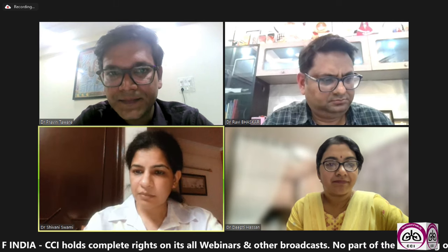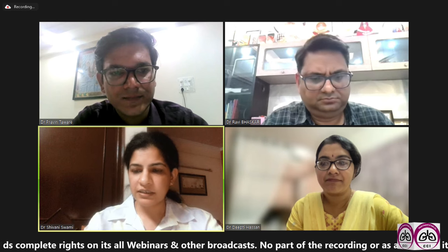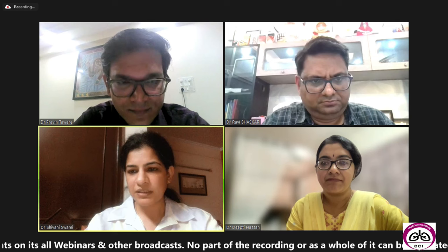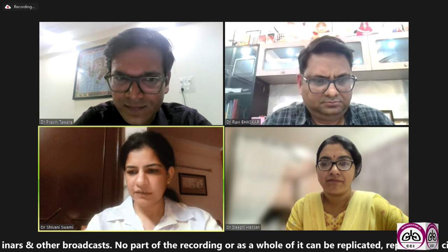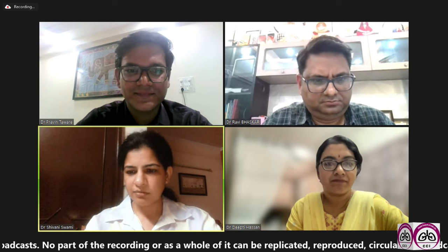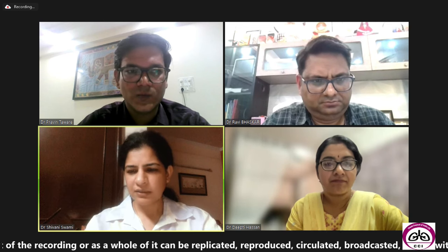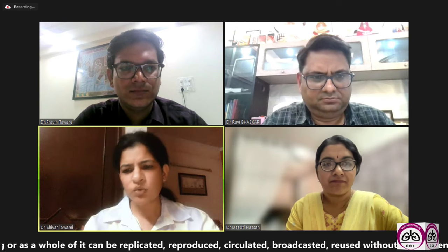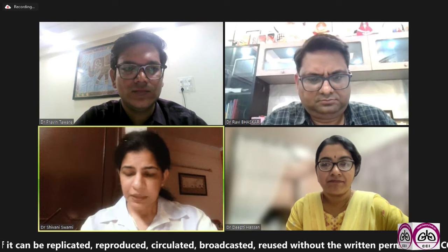Right. Next is a comment from Dr. Ajay Lanjewar from Maharashtra. Sir is saying that a breath-actuated device is costlier than an MDI and spacer, as a spacer is a one-time purchase for one year. Yes, with that logic, definitely, sir, it is. But I myself actually buy and use the Foracort Synchro Breath, and it costs somewhere around 500 something for an entire month. So I think that's totally acceptable and most people can actually afford it.